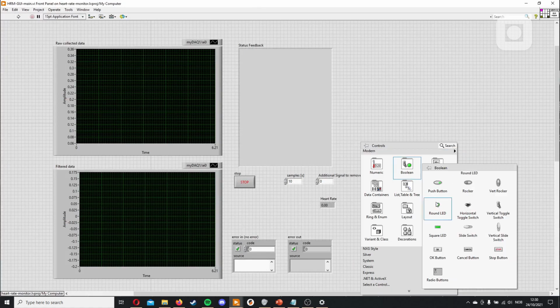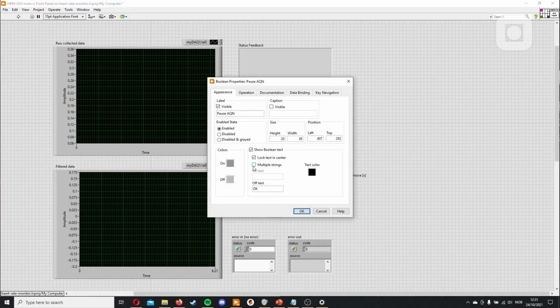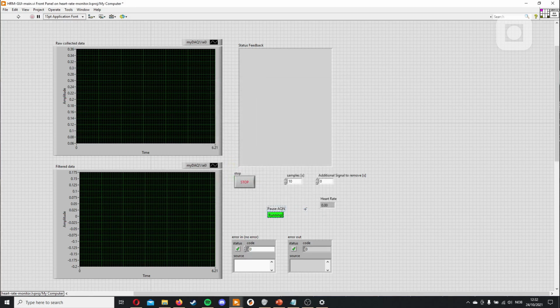And we'll add a button in the acquisition. We call it pause acquisition. And then we can go inside here and have 2 different values. So when it's not, we can have running. And then when it's paused, we have paused. And we can also make yellow for paused and green for running. And let's make the text bigger. Running, paused.